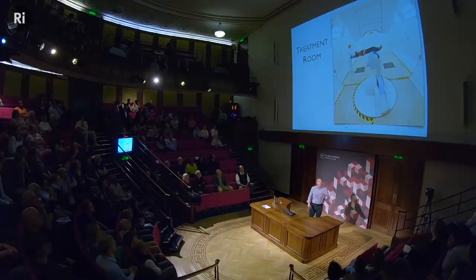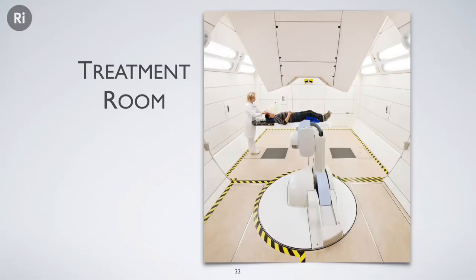That also gives you some idea of why proton therapy is not routine. It's very large technology, and it's useful in specific cases where you really get the benefit of this very tight dose distribution. But when you do, and you can deliver the beam to the patient, you see real advantages.